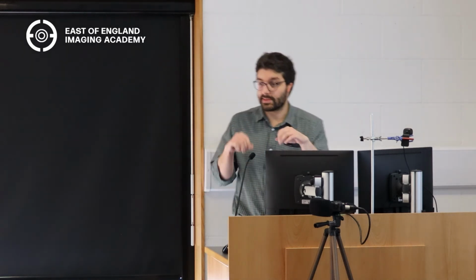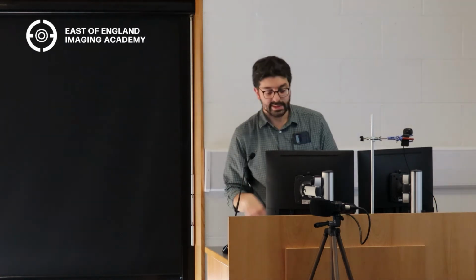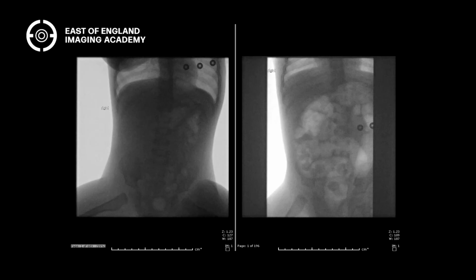So what do you do? So an ileocolic intussusception is basically when the small bowel goes into the large bowel. Okay, causes obstruction, PR bleeding, all that sort of red currant jelly stool, which you may remember from medical school. So the patient had an intussusception. What do we do? We basically insufflate gas into the rectum, and you then push back using the gas pressure. You push the intussusception back.